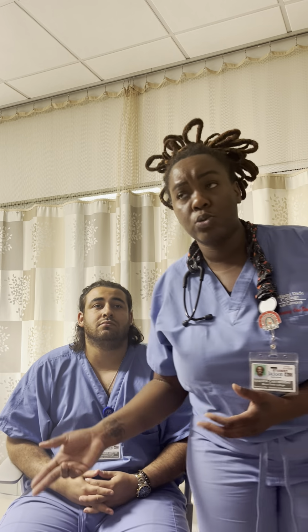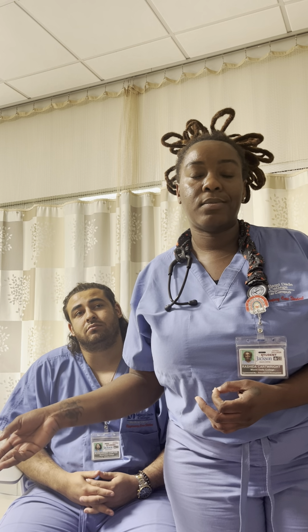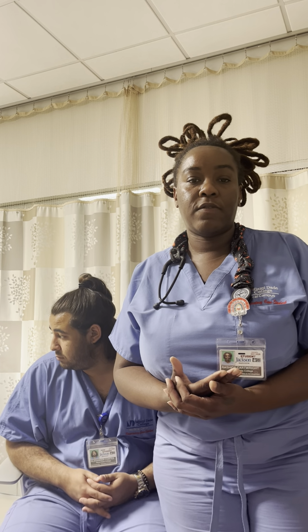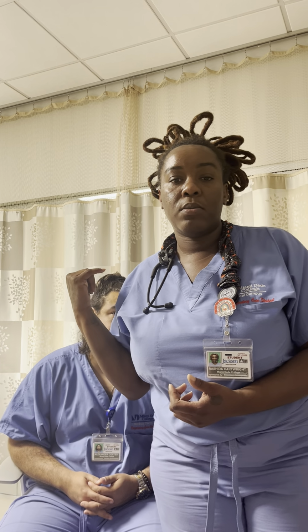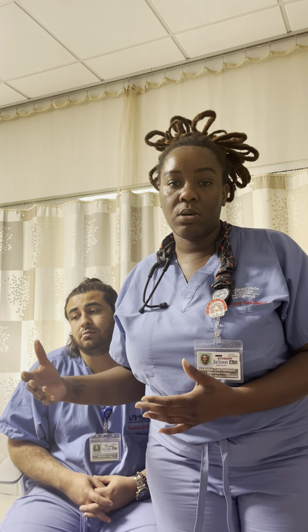Hazards of this would be hypoxemia from the interruption in O2. Other hazards would be hyperventilation, fatigue, bronchospasms. Okay. And also this would be ineffective. It would be an ineffective technique without the patients doing the right thing.